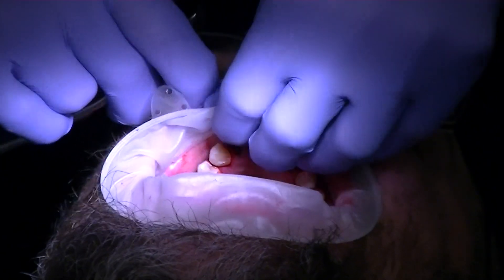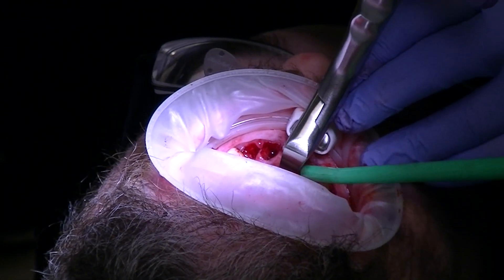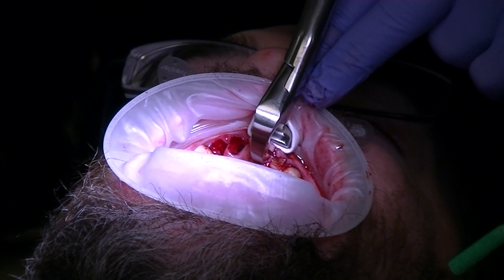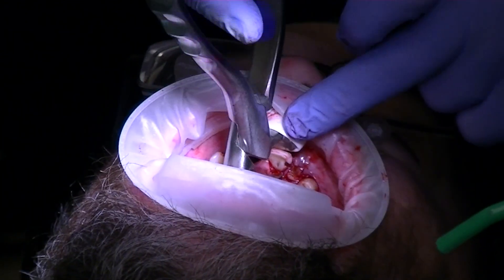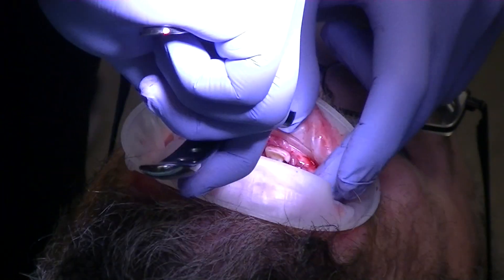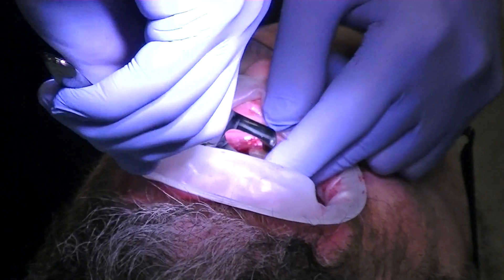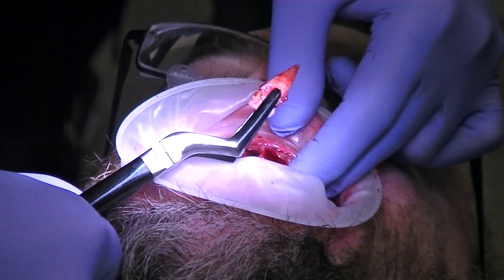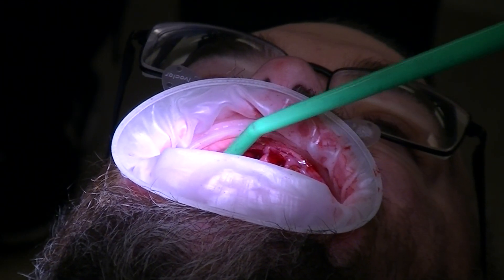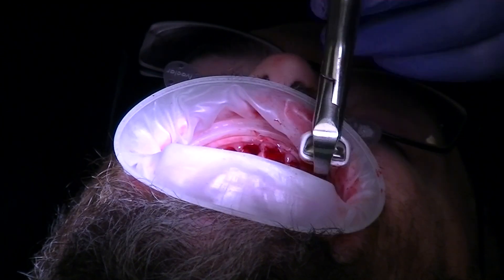Let's fix this under your lip. Not a very big vestibule here — make sure on the long axis. Put a little pressure — there we go, I saw it move. A lot of this is just by feel. This is the tooth delivery by the way, so I can use this even here. You can see it's a good-size tooth. Periodontally his teeth are actually pretty solid — these are coming out because of the decay, not because of periodontal issues.